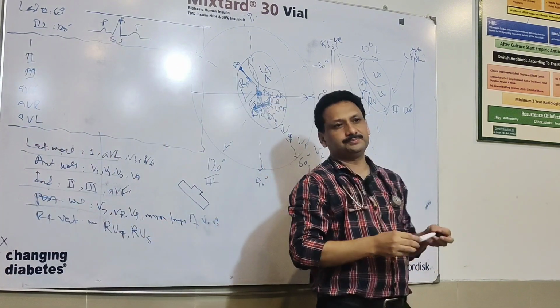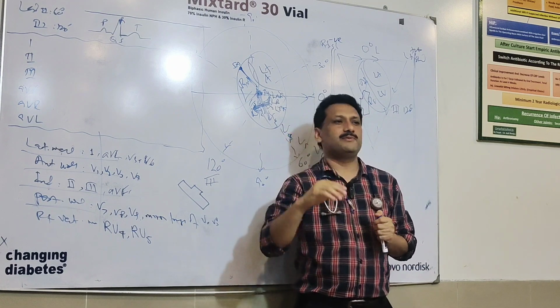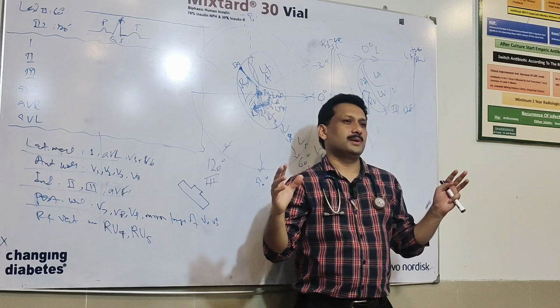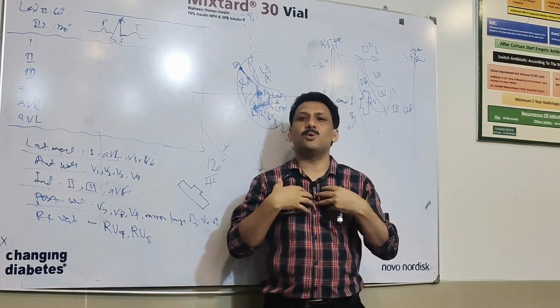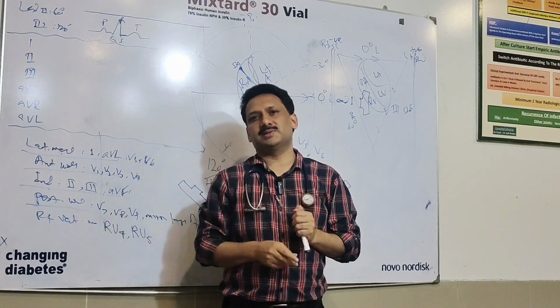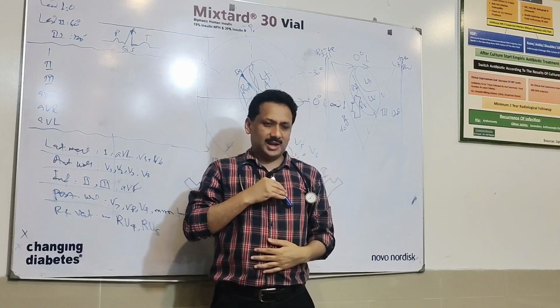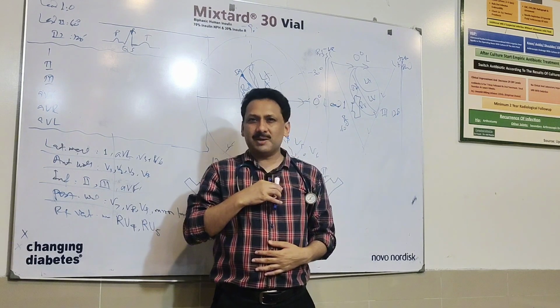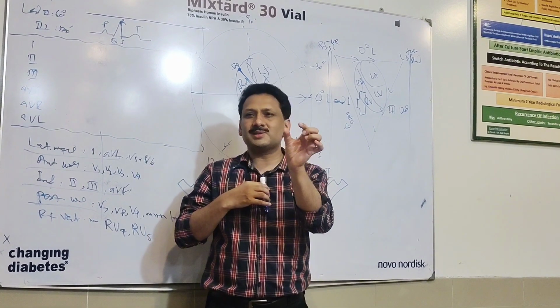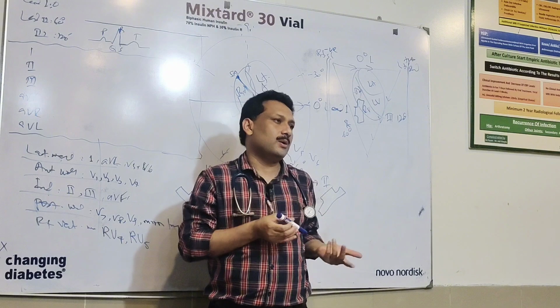Rule number 1, as per the rules of physics, again recall physics. I already told you that current is being dissipated in all directions. Recall the rule of vectors in physics. On the right side, the muscle mass of the right ventricle is less in comparison with the muscle mass of the left ventricle on the left side.